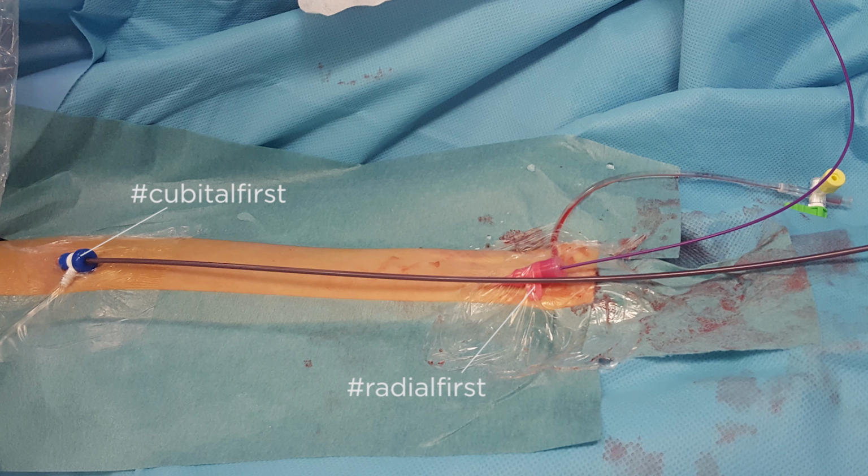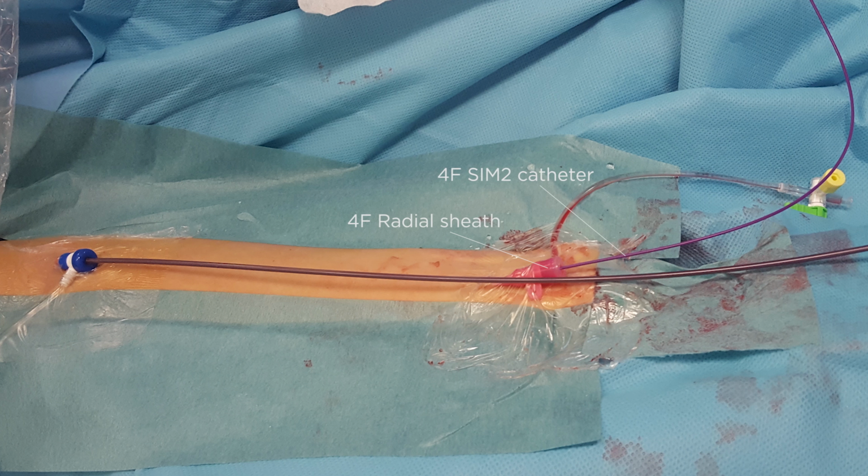Okay, so if we stop our video in this first frame, you can see our setting in the angio, where we use a radial first approach for the arterial side with a 4 French radial sheath and a 4 French diagnostic catheter. This is a SIM catheter that I placed in the carotid to be able to control the fistula. And you also see the cubital first approach for the venous side, where we placed an 8 French normal femoral sheath in the antecubital vein, and then with a 6 French long sheath I was able to navigate towards the internal jugular vein and then the superior sagittal sinus.